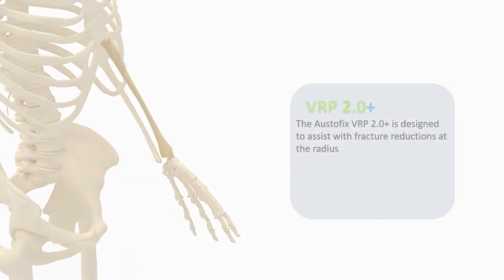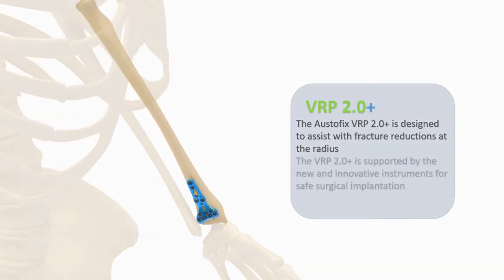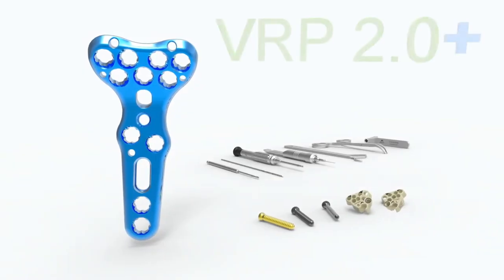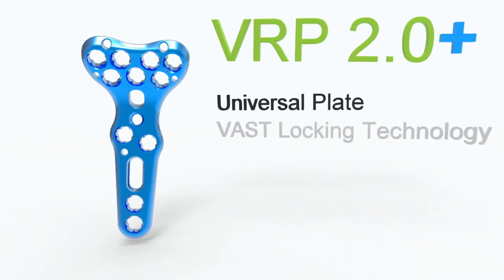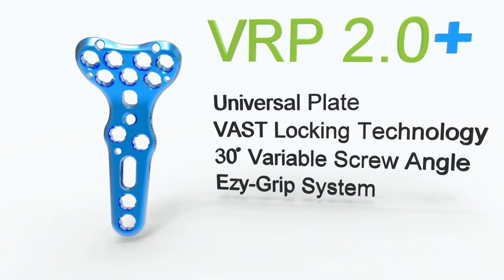The Austofix VRP2 Plus is designed to assist with fracture reductions in the radius. The VRP2 Plus is supported by new and innovative instruments for safe surgical implantation. Key features are the universal plate design, vast locking technology, 30-degree variable angle screw angle, and easy grip system.